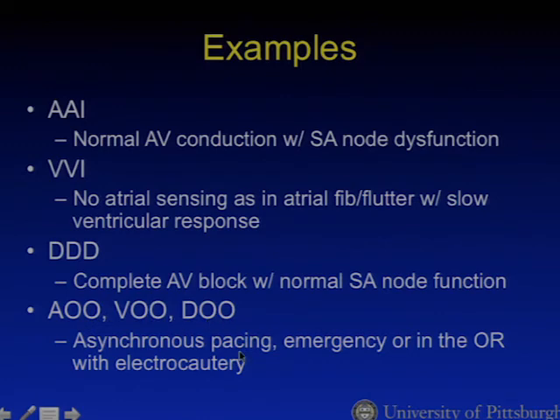These are really only appropriate for intraoperative use or emergency pacing, with the concern here being that eventually R on T phenomenon and an unstable arrhythmia may occur.